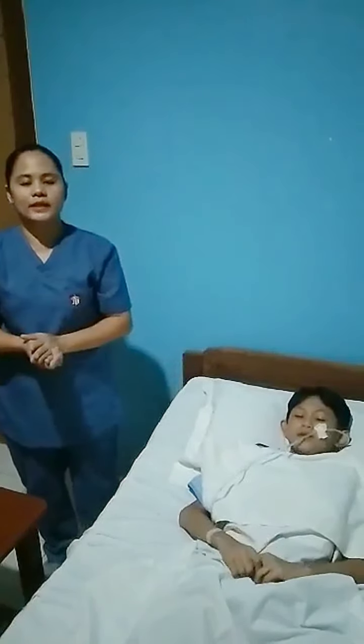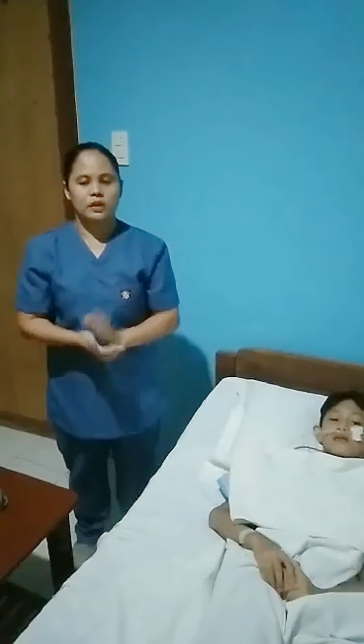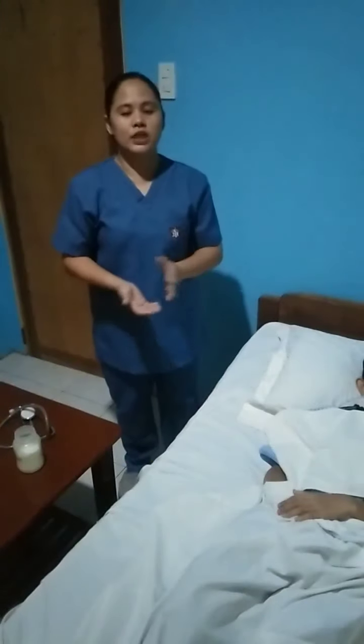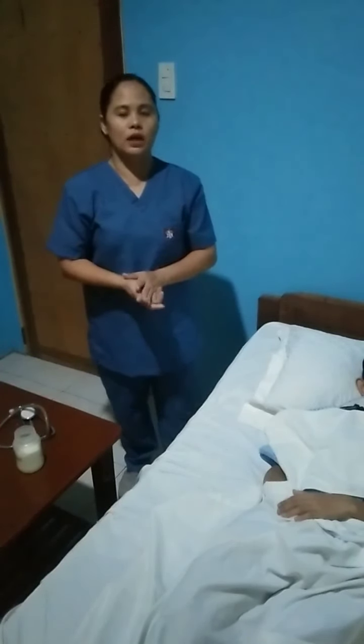Next is to test the placement of the tube and check for residual formula, since it may have been dislodged in between feedings. To check the placement, first we can inspect the tube. After inspecting the tube, we can now auscultate for the whooshing sound.